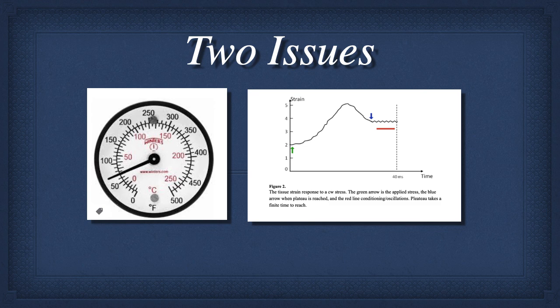So it's a great technique. We can use OCT with a parallel ultrasound beam or even an infusion of something. But if we look first on the left, if we were trying to tell somebody's temperature, but we used gradations like this on the order of tens, could you distinguish between 99.8 and 102 with that meter? Not really. Accurately? No, not at all.